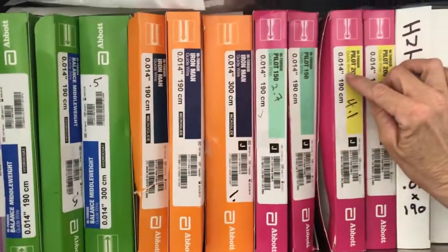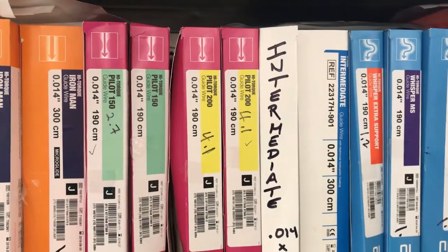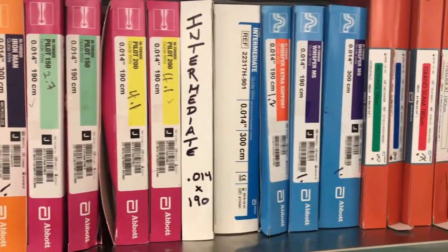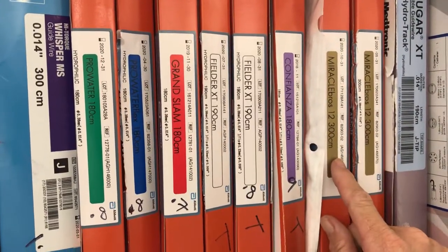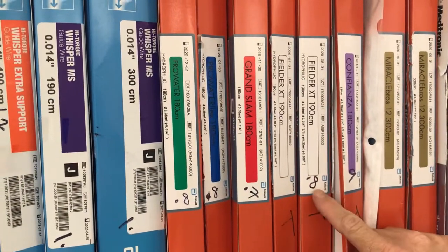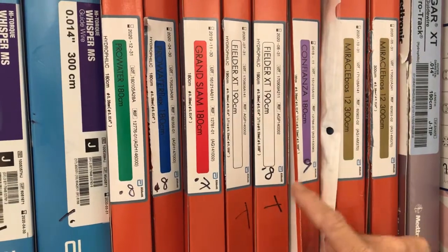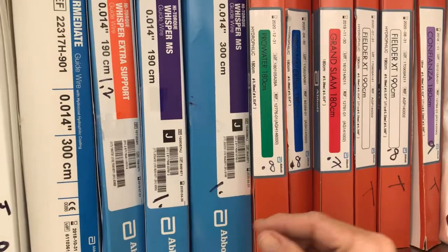You'll also see the outer diameter of the wire — 0.014 — labeled on all your boxes. All coronary wires are going to be 0.014 or smaller, so look for that. Next, you'll see tip load. Some manufacturers will put it on there — for example, Miracle 12 is a 12-gram tip load. Fielder doesn't have it on the box, but it is a 0.8-gram tip load. Confianza is a 9-gram tip load, Grand Slam 0.7, etc. If the box doesn't have it, we've written it on for you.